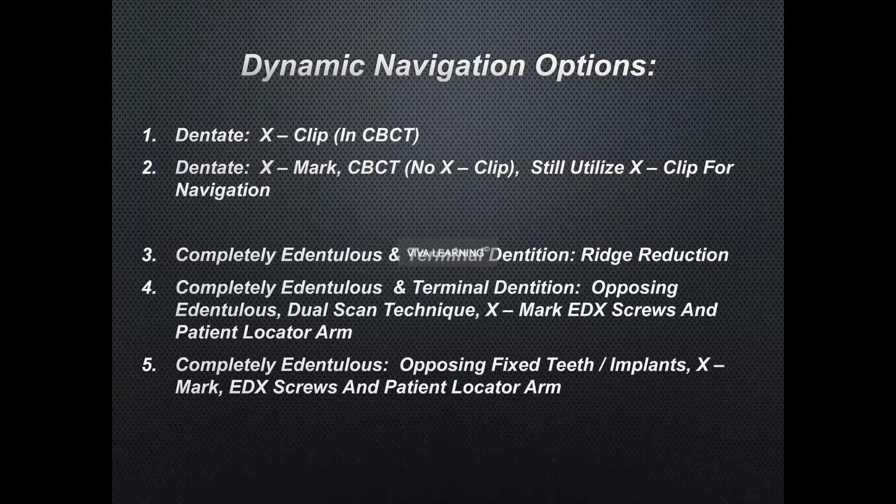When we're talking about navigation options, you can use an X-clip and your CBCT to register your patient. Now, again, we talk about the advancements in the 5 or 6 years that I've had my technology. We now have seen where they're able to send us another type of technology called X-Mark, where we don't need an X-clip in their CBCT. We're able just to take a CBCT that we take, or a CBCT that your referring docs may send you, and treatment plan that as well at that time.